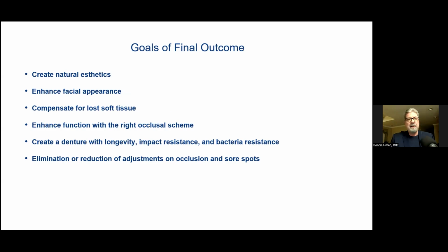And the goals for that final outcome: we want to create natural aesthetics, enhance facial appearance, compensate for that lost soft tissue, and enhance the function with the right occlusal scheme, whether it be physiological centric occlusion or lingualized occlusion. We have to pick the right occlusal scheme also, and create a denture with longevity, impact resistance, and bacteria resistance, and we want to eliminate and reduce those adjustments on occlusion and those sore spots.